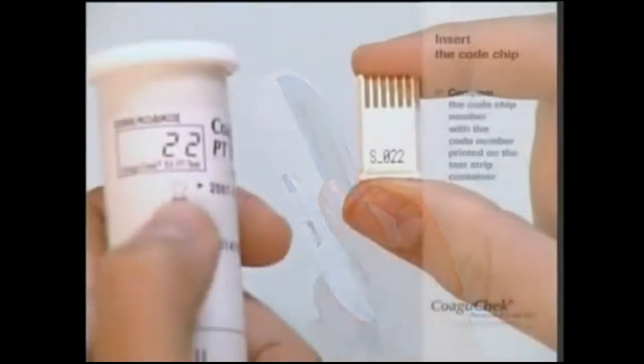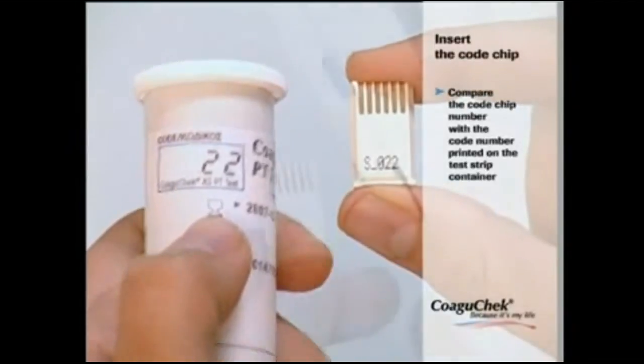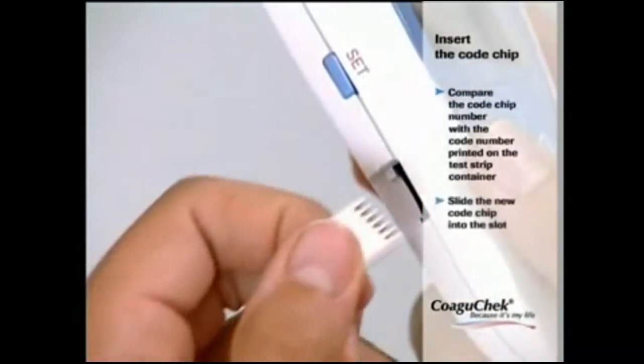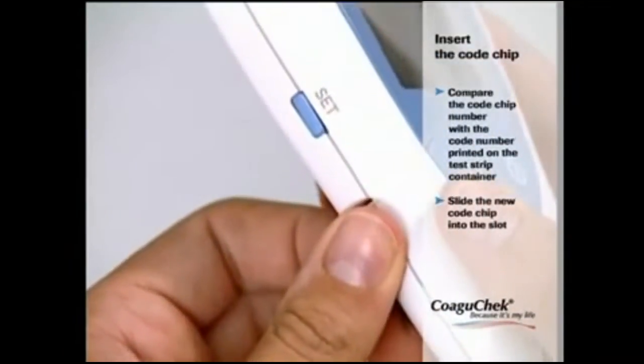Please always ensure that the number on the code chip matches the number on the label on the test strip container. Slide the new code chip into the slot on the side of the monitor until you feel it snap into place.